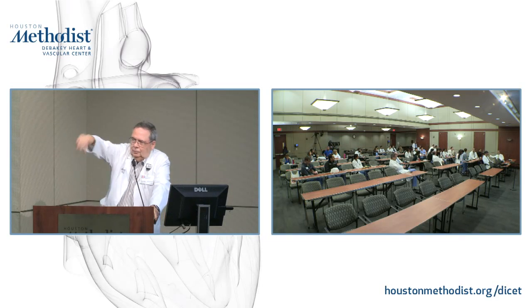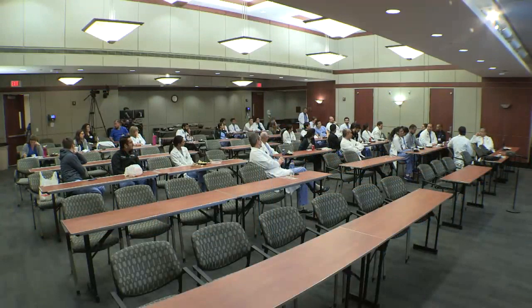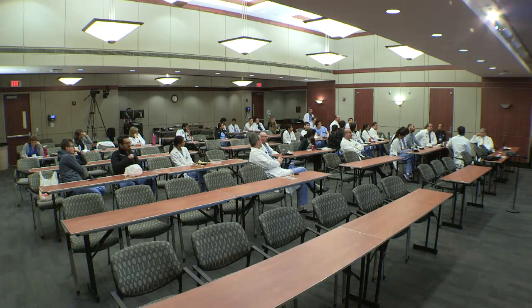I just want to add one additional trial for CT in the emergency room. It was done in the Netherlands, and that one compared CTA to a cohort that used high sensitivity troponin. And the benefit of CTA over usual care utilizing high sensitivity troponin kind of wiped out. The time to discharge was the same, and there was a little difference in cost towards CTA, but we all know that this very much depends on the cost of CTA and the reimbursement in different countries.